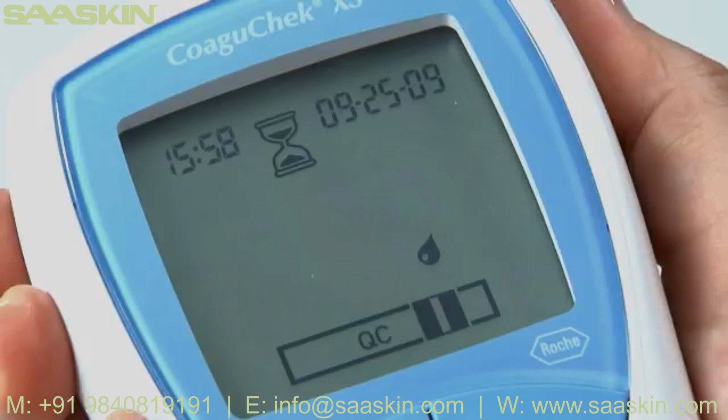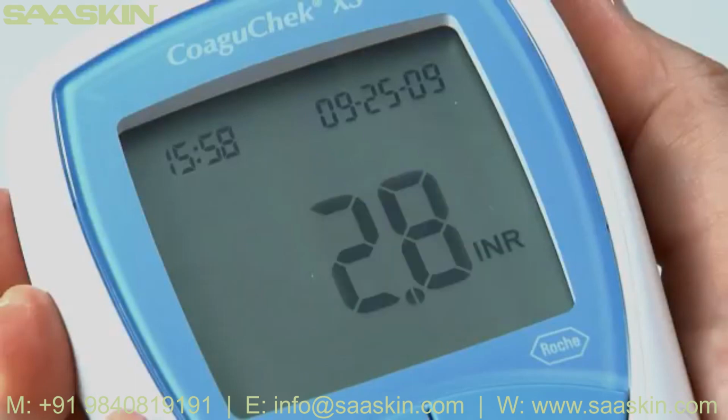The meter performs an automatic quality control check on the test strip, and QC appears on the display. Following a successful outcome of the quality control check, a tick appears after QC and the coagulation measurement begins. The hourglass flashes until the result is displayed. It is automatically saved to memory.